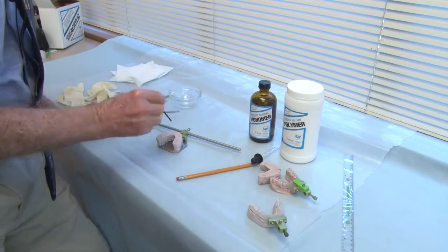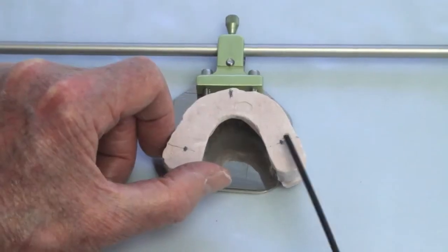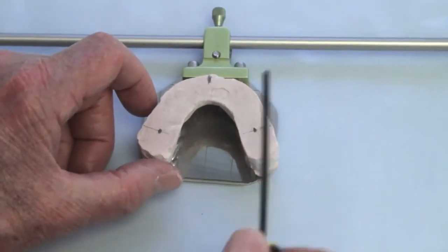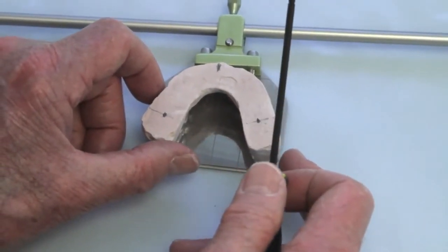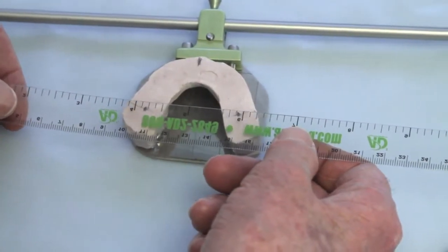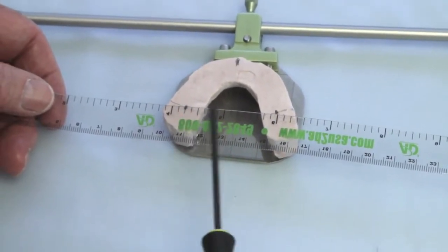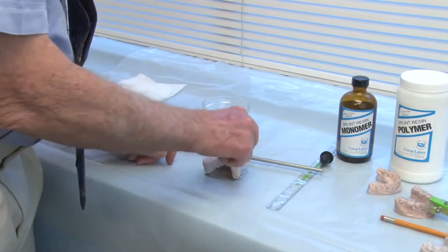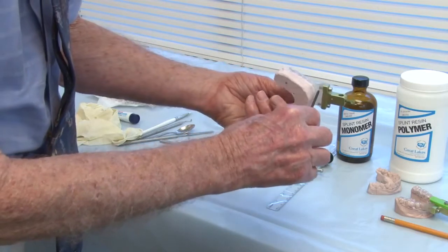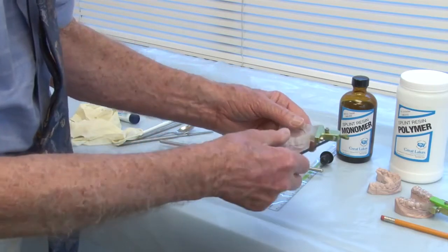And then I got the center lined up, but I have to look at the lower first molars now and judge those lower first molars in relation to the lines here, and making sure they're the right distance. Now, if I want to be even more critical, I can put a ruler on here, line it up with the center line, and see if I'm about equidistant. And then you have your quick cure acrylic added to attach the two.